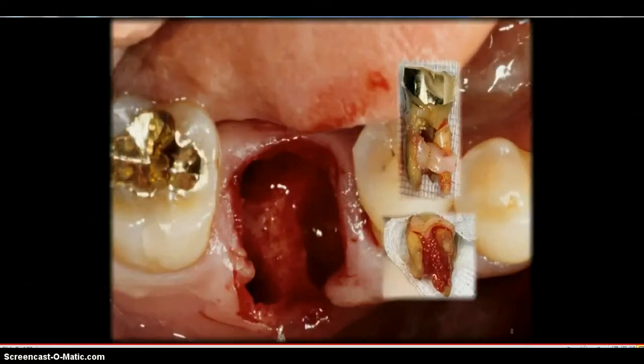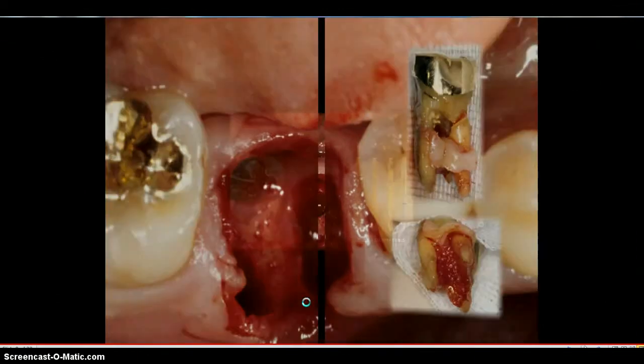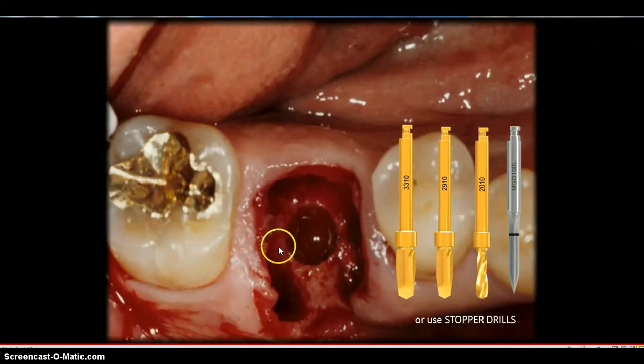So let's look at a molar process real quickly. Here is a very unique scenario because you have a 3-rooted mandibular extraction socket and molar. In the old days, we used to have to remove this area here with a trephine and place your implant right in the center. Well, now we can use a drilling process. Here are the 3 drills that you would use, and this is your workhorse of what you're going to be utilizing with this implant system: 2.0, 2.9, and 3.3.